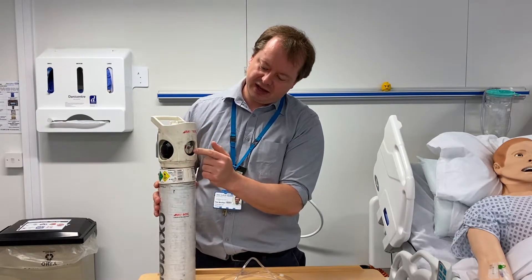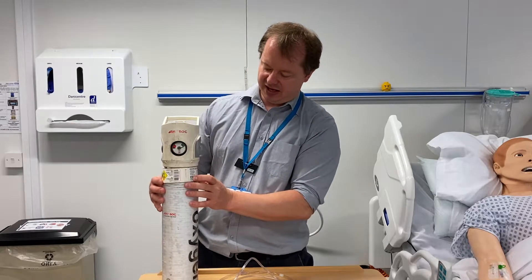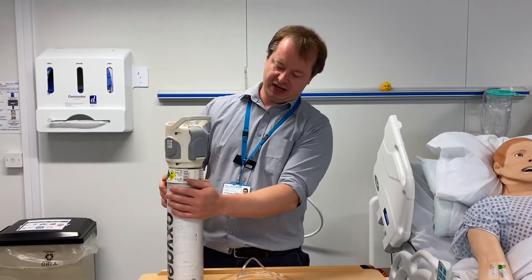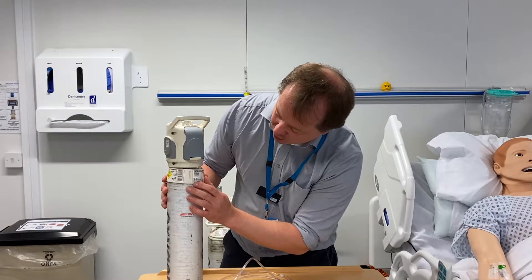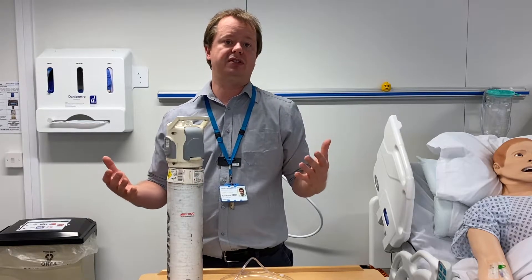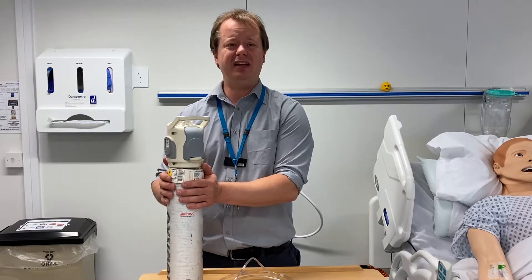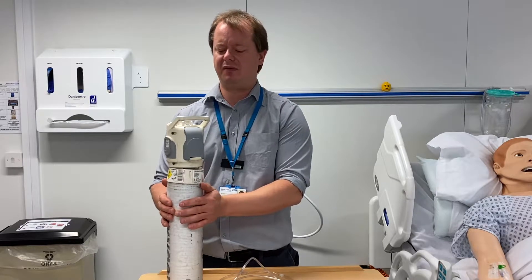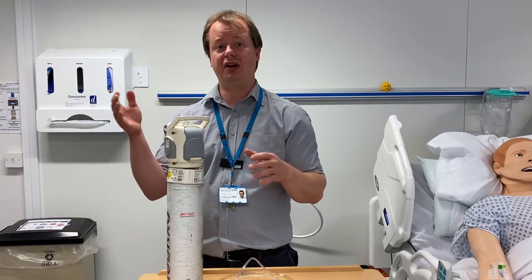Another feature of the oxygen cylinder is the gauge, which tells you how much oxygen is in it. The name of this cylinder is a CD oxygen cylinder and it contains 460 litres. If you want to use it to transport your patient somewhere else in hospital and they're receiving 15 litres per minute, it only lasts about 15 to 20 minutes. So if you are transporting someone with this cylinder, think carefully about how long your journey takes.